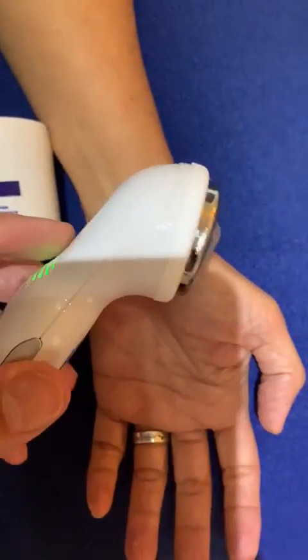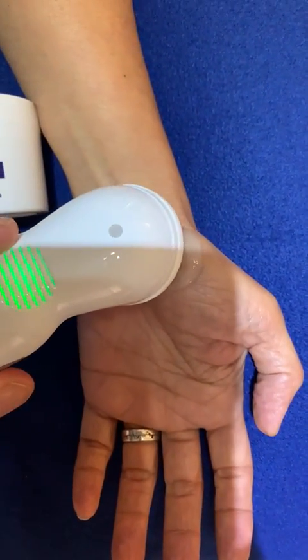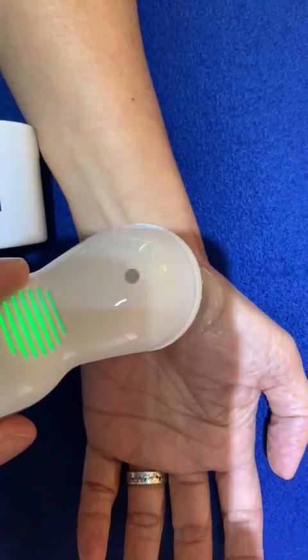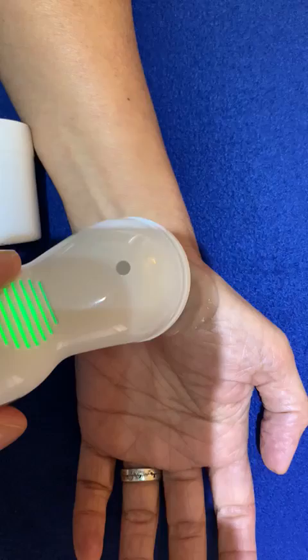Then apply the ultrasound probe to the affected area and use in a circular manner. Apply for between two and three minutes.